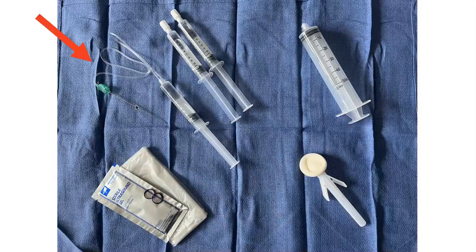Here are the supplies you'll need for the procedure. This is one of the echogenic needles with tubing attached, located in the cart next to the suture material in the department. It's shown here flushed through with saline, along with a couple of additional saline flushes, which we'll discuss when looking at procedure clips. You'll also need a 30 to 50 cc syringe for your medication, a chlorhexidine swab, and a sterile ultrasound probe cover.